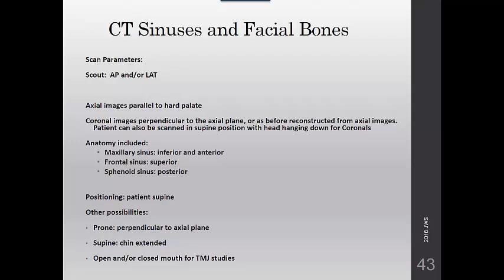So this brings up another topic in that it used to be common practice to scan the patient in axial and in coronal planes, but that's no longer the case in most facilities with the multi-slice scanners. The advantage of scanning in both planes is that the technologist is able to demonstrate changing air fluid levels and other sinus-related diseases because the patient actually changes planes.